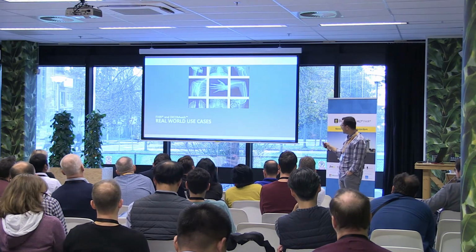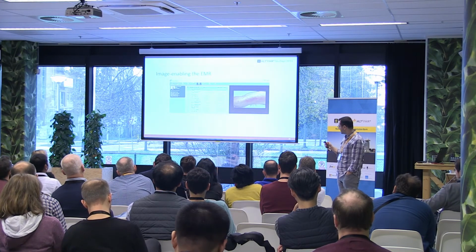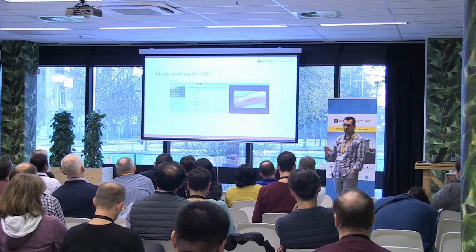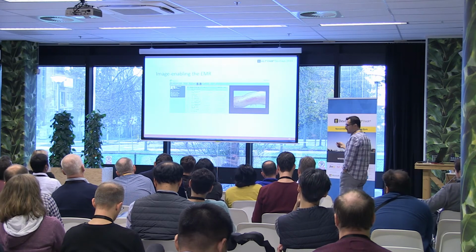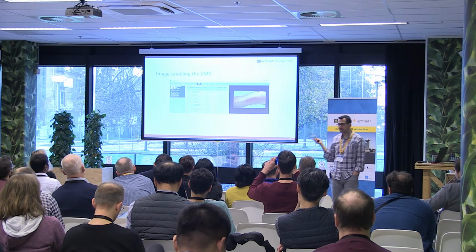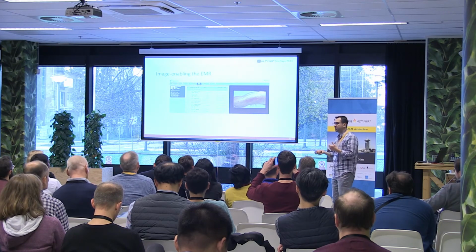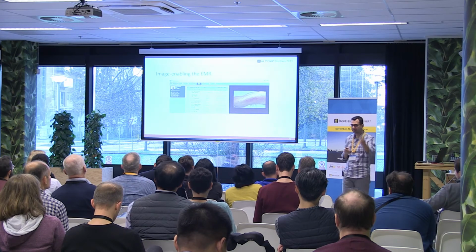There's an example that correlates it, but I'll skim over. So real use cases. So one of the use cases, say you have an application like an EMR or some kind of patient portal, and you want to be able to show images. There's a simple, may I say, naive example. The reason why I say naive is, remember when I talked about images in DICOM and I said most people tend to think about grayscale images like CAT scan or X-ray.